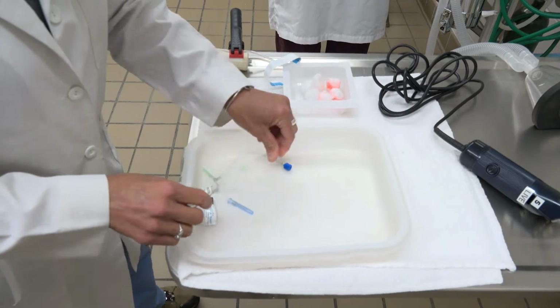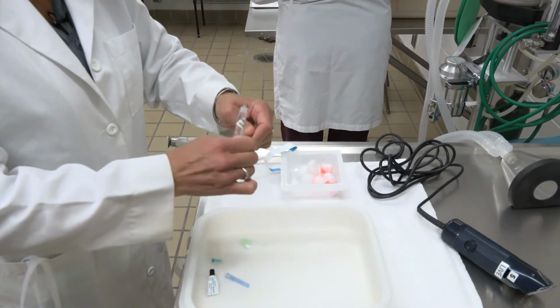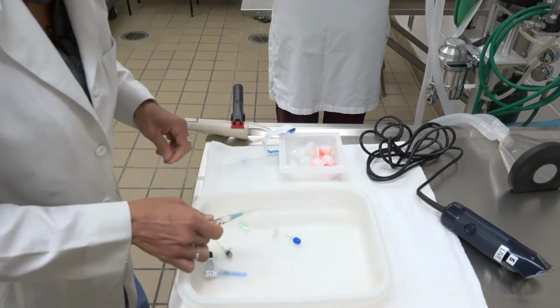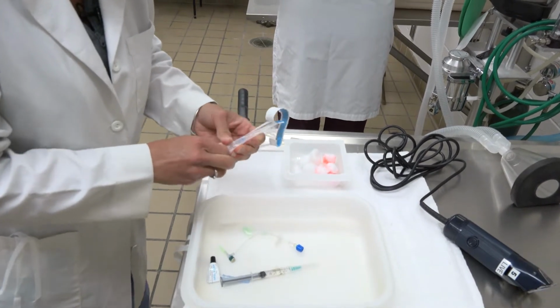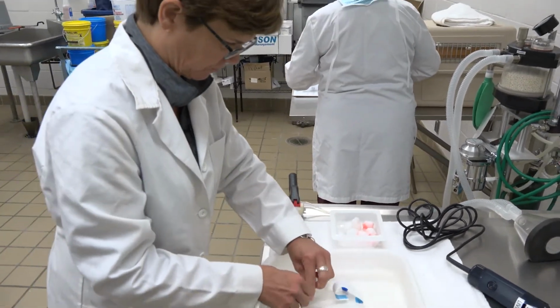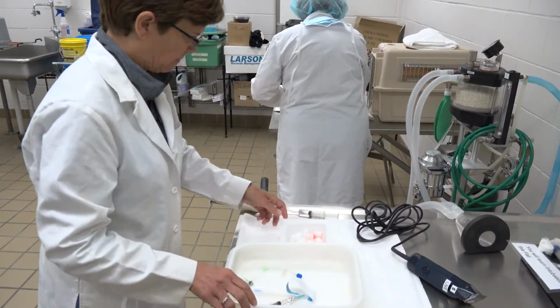Okay, so I have my catheter supplies. I need to flush my T-port. I'm ready to be sterile. Opening the catheter. So is our cat ready? Yes. Okay, Dr. Spence has our cat pre-medded and ready to go.